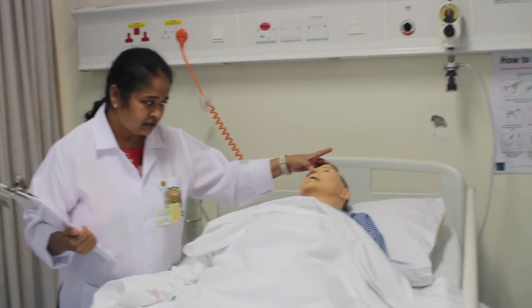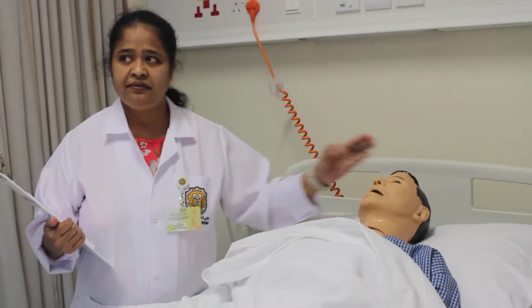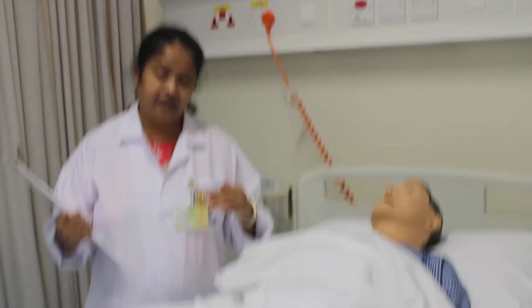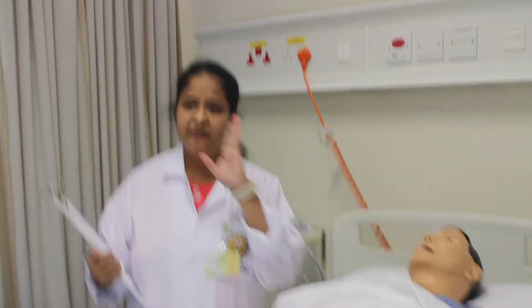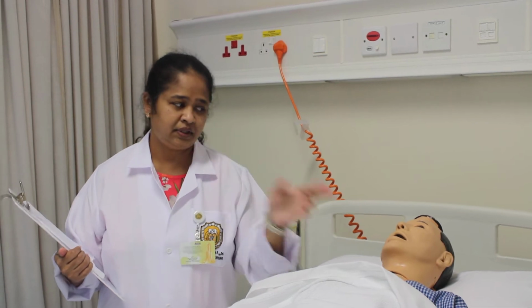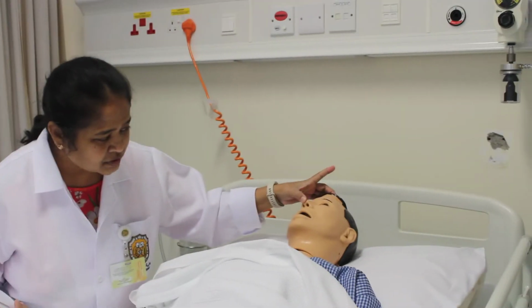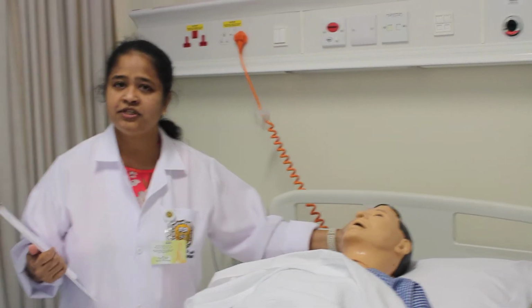Now his nose, whether he has undergone any nasal surgery? No. Whether he has a deviated nasal septum? Deviated nasal septum means maybe they had some injury when they were small. It could have moved the septum of the nose to one side. So you see which nostril is better for us to use. He does not have such a problem.